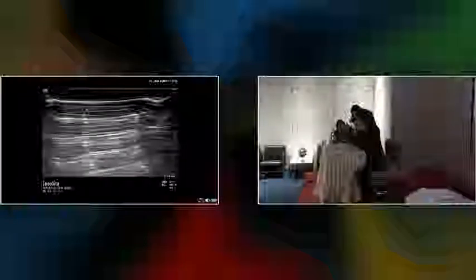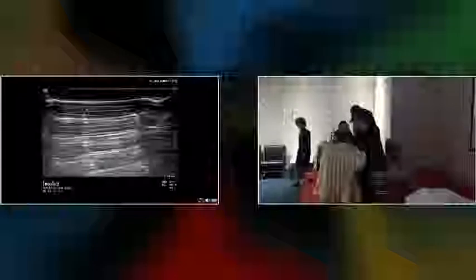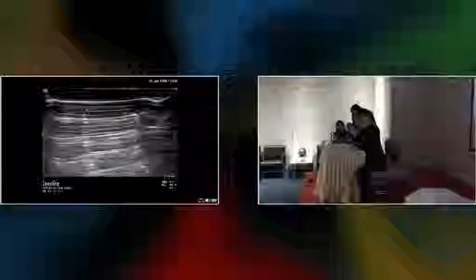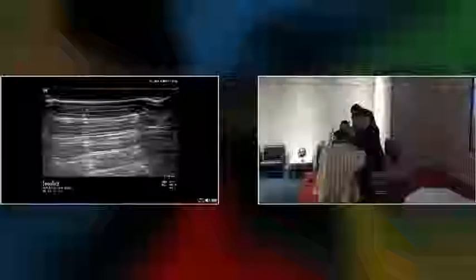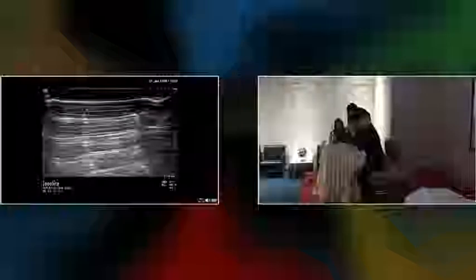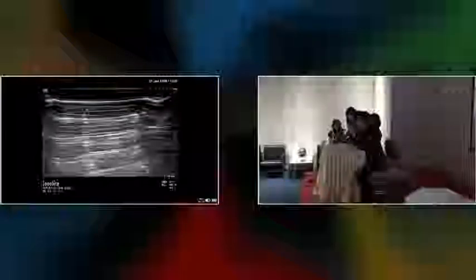And for today's last session, it will be head-to-toe common sonographic scanning for pain medicine, with live demonstration. We have a short lecture and then the ultrasound scan. Dr. Nanason Sin Bunyakun will be the moderator today.